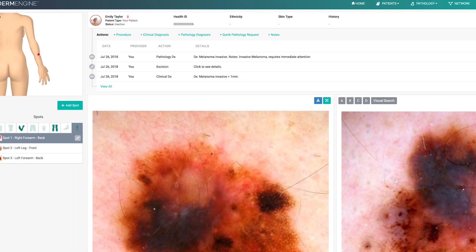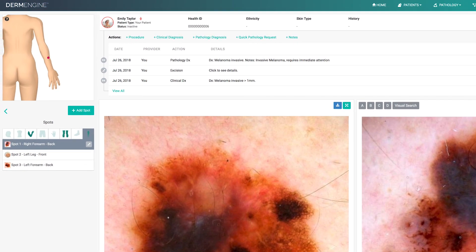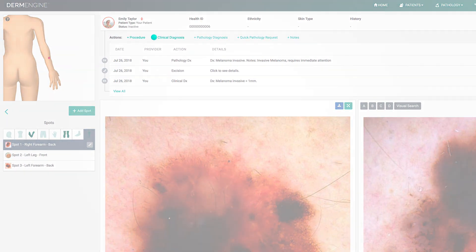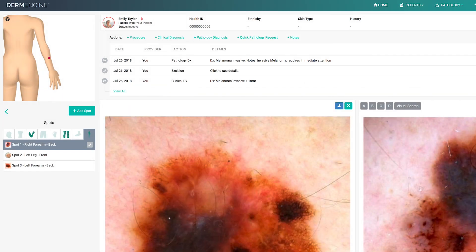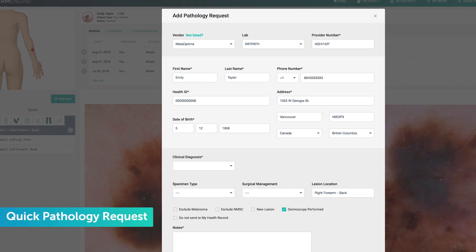A quick tip, to save time in your clinical workflow, instead of documenting clinical diagnosis, procedure, and then pathology request, you can easily do all of this by just selecting quick pathology request.